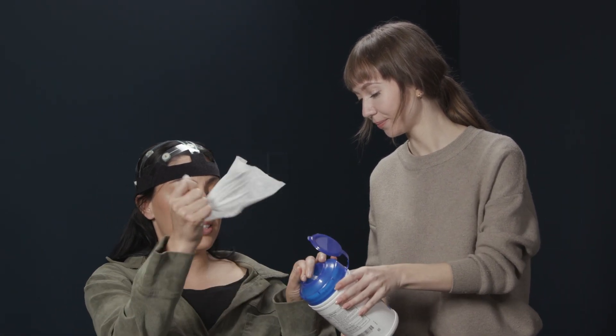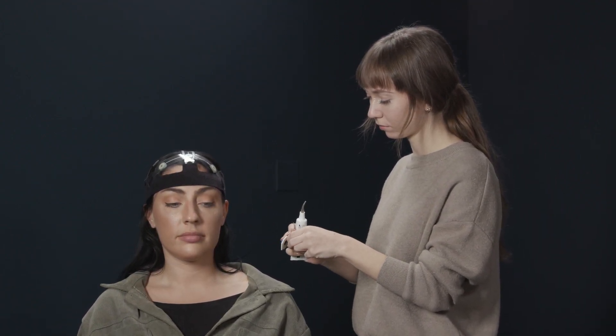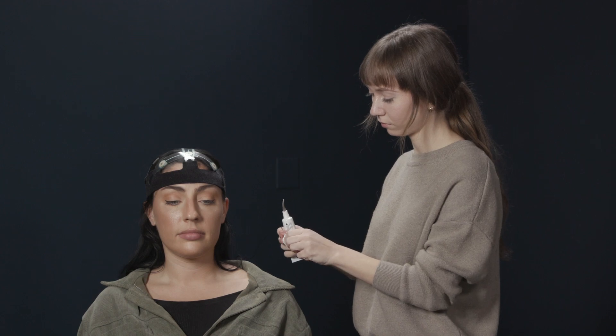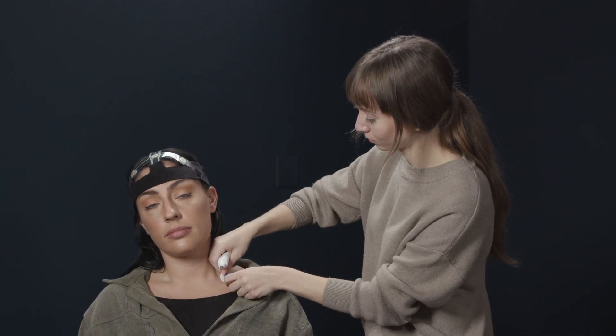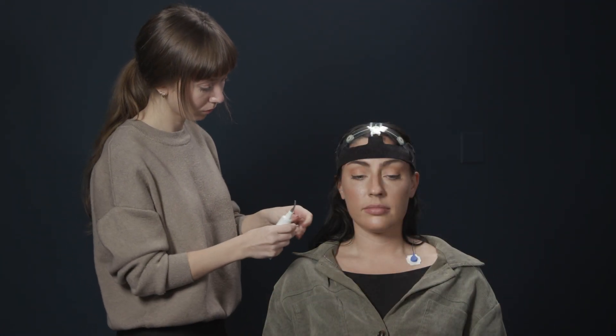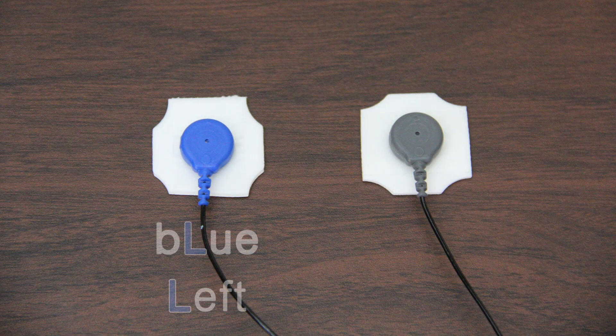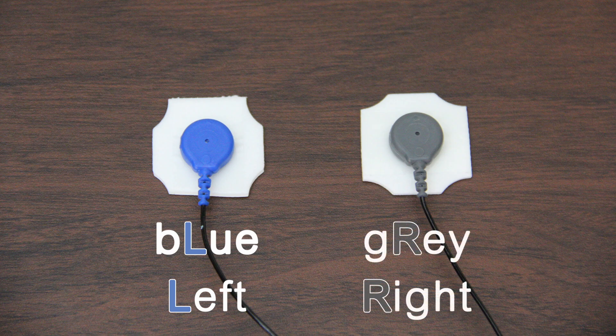If you are using the ECG leads, ask the subject to wipe their clavicle or collarbone on their left and right side with an alcohol swab. Allow the skin to dry. Snap adhesive electrodes to the end of the ECG lead cables. Beginning with the lead connector colored blue, attach the electrode to the subject's left clavicle or collarbone. Then, with the lead connector colored gray, attach the electrode to the subject's right clavicle. Remember, both blue and left have the letter L for the left side. Likewise, both gray and right have the letter R for the right side.